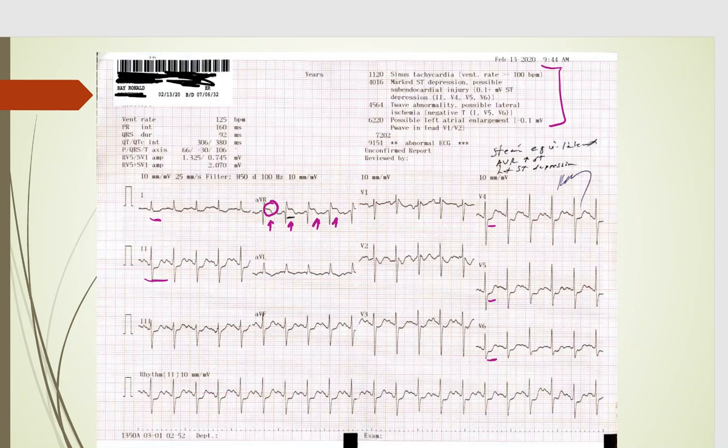It's much more important for you to read the EKG yourself. What does this mean? It can be LAD occlusion, it can be severe three-vessel disease, it can be left main. Bottom line: this is pretty significant and the patient needs to go to the cath lab and be treated just like it was a STEMI.